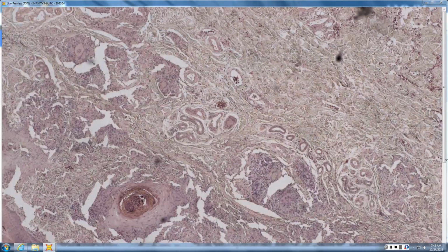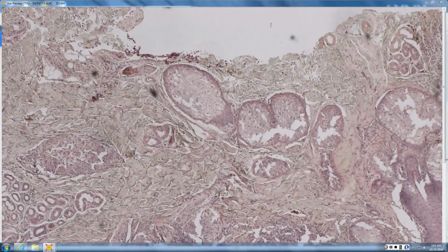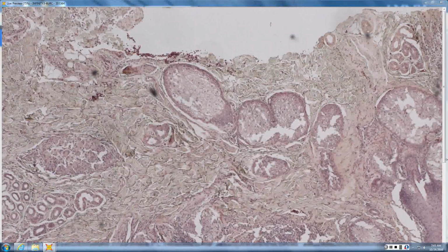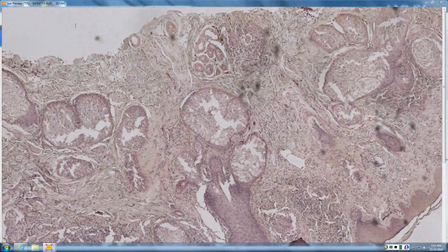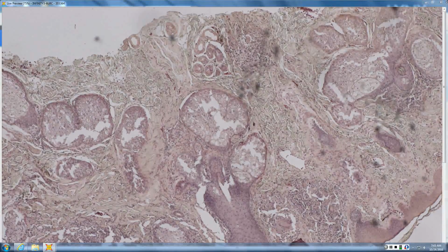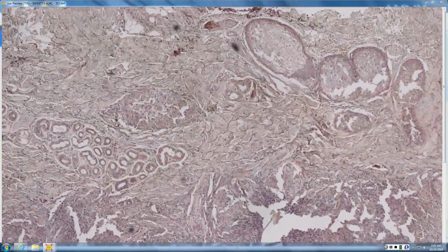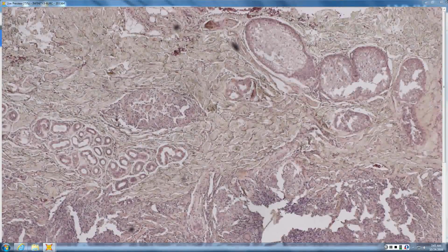Okay. Iris, what do you see here? So there are granulomas. And you can see them there with giant cells. And there's also all of this hyperplasia of the epithelium and these collections of neutrophils. So PEH, pus, and granulomas.